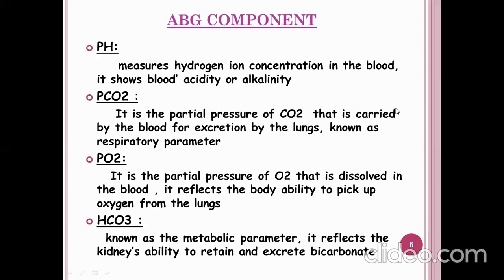What does it mean? It reflects the kidney's ability to retain and excrete bicarbonate. When I was talking about the partial pressure of oxygen, it reflects the ability of the lungs, whereas bicarbonate reflects the ability of the kidney.